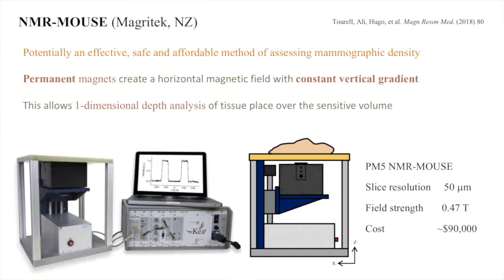We used commercially available portable NMR instrumentation, known as NMR mouse. It costs a very small fraction of high-field MRI scanners. It is based on an assembly of permanent magnets and requires no cryogens, therefore it also entails minimal maintenance costs.